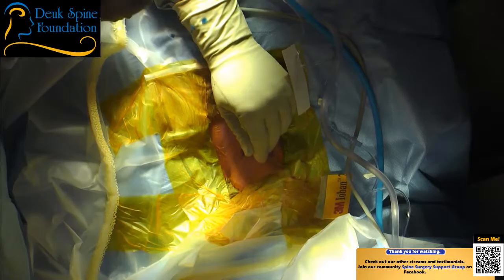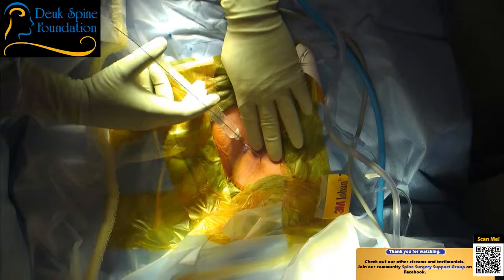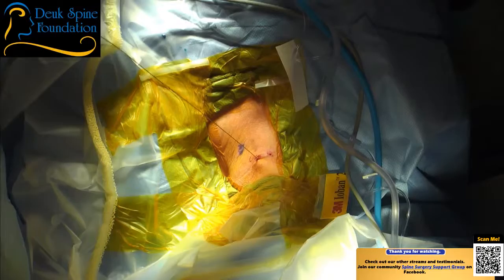Now that I have a guide wire, I know I have a safe passage past important things like the carotid artery, the jugular vein, the esophagus, the trachea. These are all structures normally found in the neck and that are at risk with surgery on the neck. I injected half a CC sub-Q, and I've got the syringe back on the field.